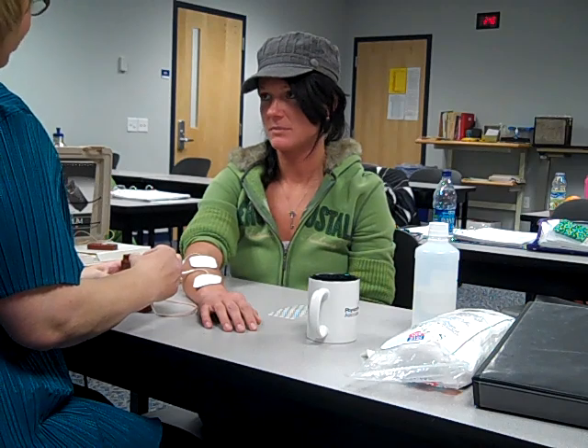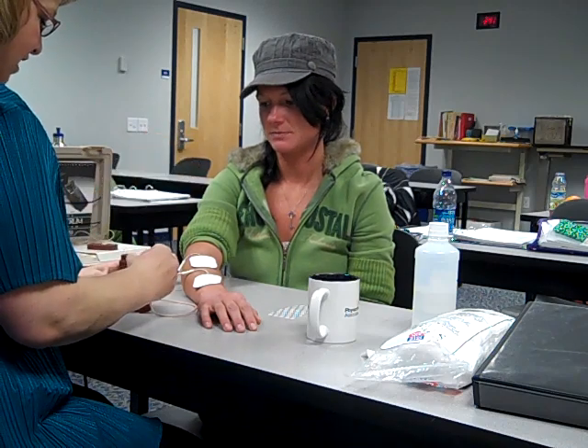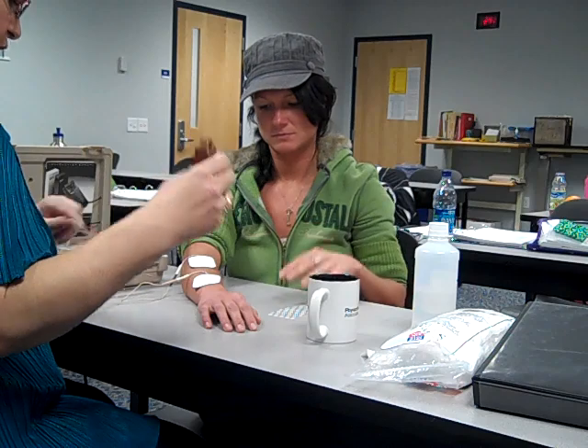It should be getting close to where you first feel something. Is it uncomfortable at all? No. So you feel how it's kind of a tingly feeling, kind of tickles a little? What I'm going to do then is have you turn it up the rest of the way — up until it starts to get uncomfortable, and then turn it back down to where it's the highest comfortable setting. We don't want it to be painful or uncomfortable at all.